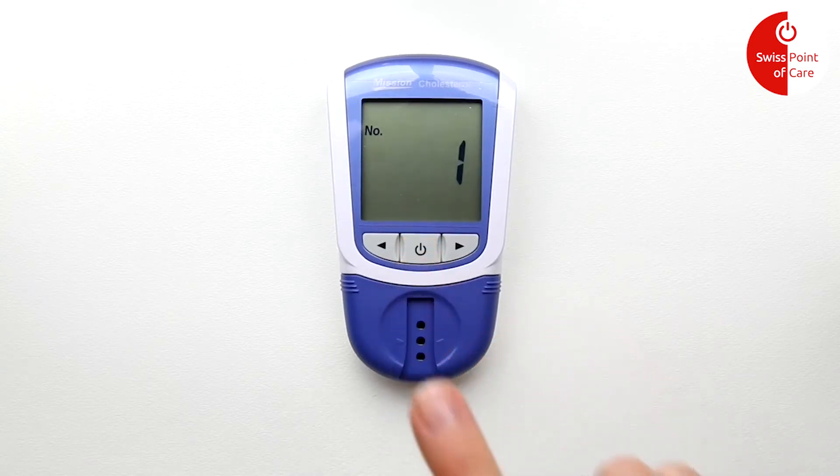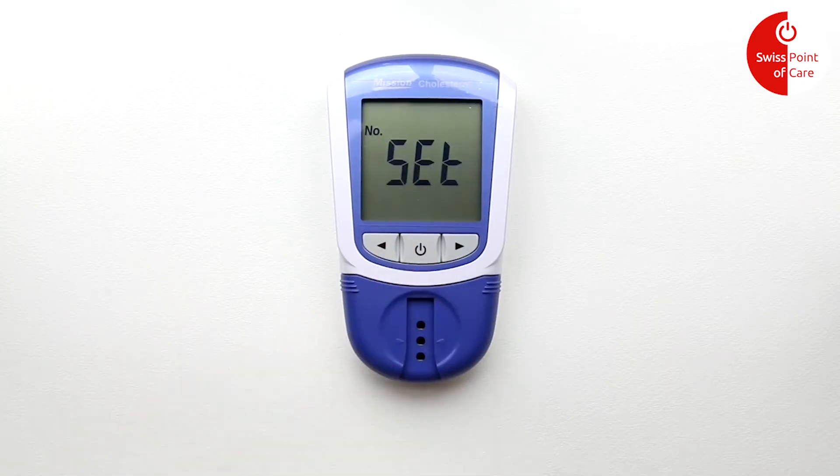Press the power button to set the first test day. Press the left-hand button once to navigate to 99 to set the first test day to start at 1. Press the power button to confirm. The display will now show 'no set'.